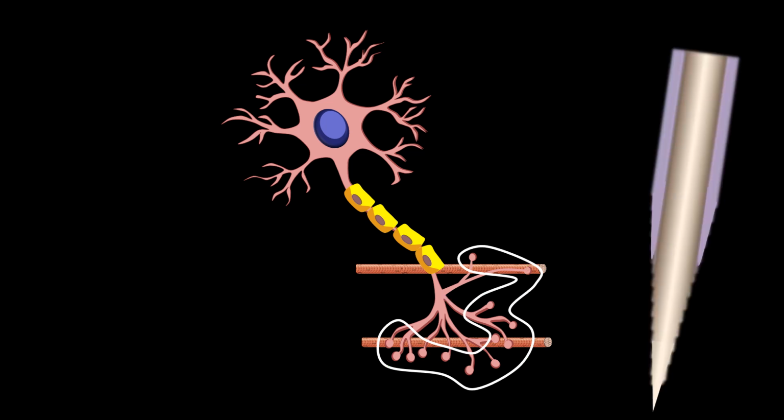In this frame, I have added the tip of a monopolar needle and projected two arrows of different lengths going from the synaptic knobs to the needle. These arrows represent the distance that separates each synaptic knob and its end plate area from the needle. Notice that both arrows fall in the recording surface of the electrode.